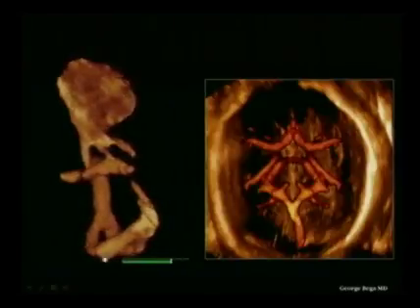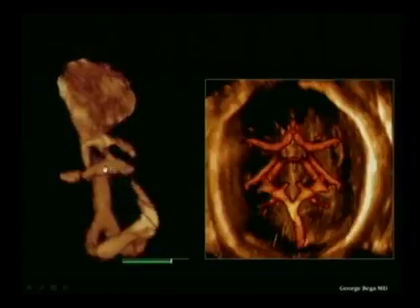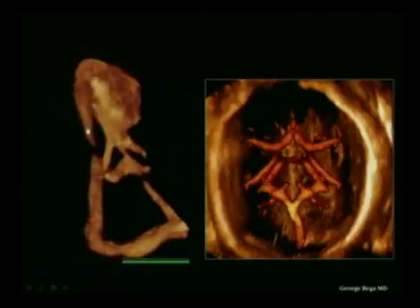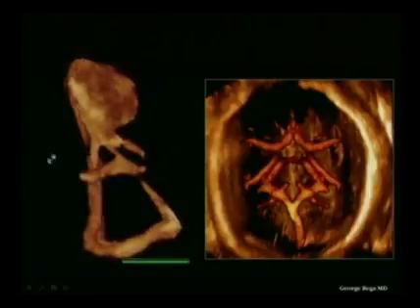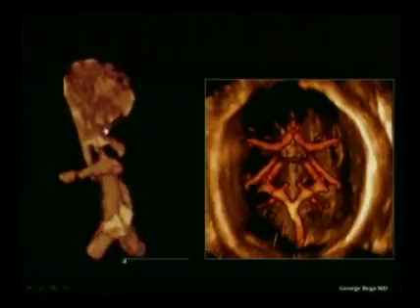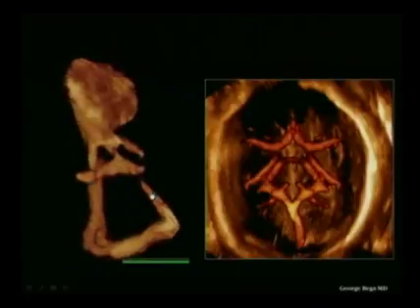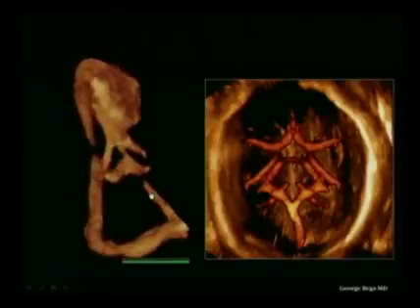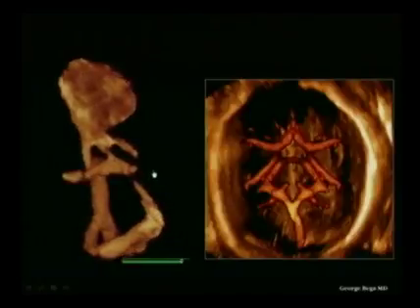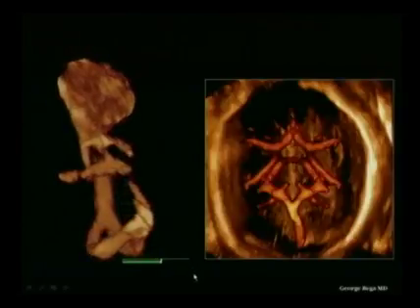This is the whole cardiovascular system. As you see here, the umbilical arteries. Here's the umbilical vein, left portal vein, ductus venosus, left and right hepatic veins, and here's the descending aorta. So this otherwise very complex anatomy of the venous return can be displayed spatially, which really helps the user judge, especially some of the very complex malformations that can happen in this particular anatomic region.